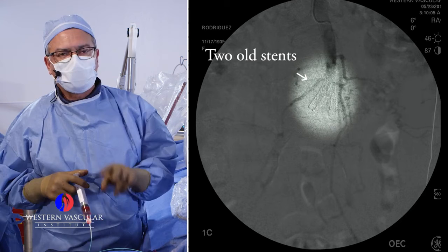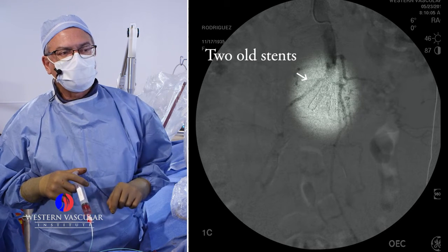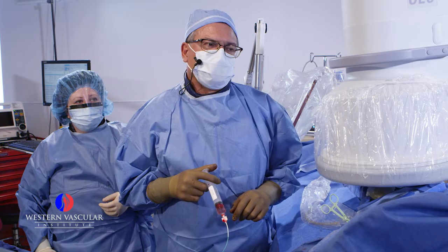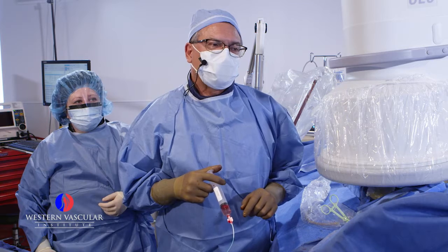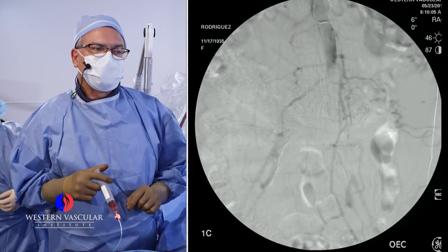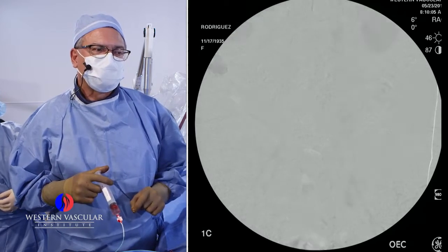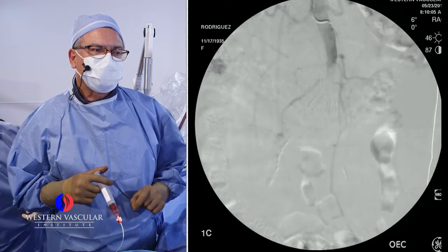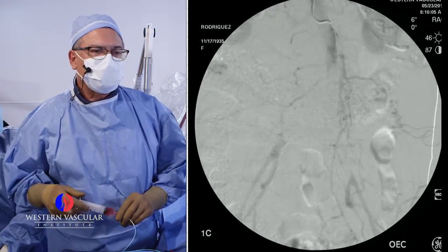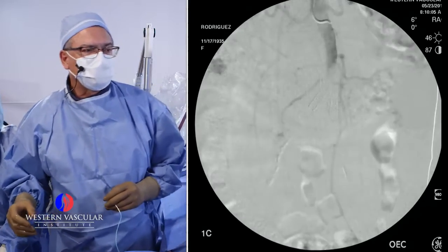That's where the aorta divides into two limbs, or two arteries, and those arteries are the beginning of the flow to the lower legs. One branch goes to the right leg, the other one is supposed to go to the left, but we don't see that. What we see instead is an absence of flow between the end of the aorta and those two branches. And you can see in the background the mesh of the two stents that were placed almost 5 years ago by another institution.